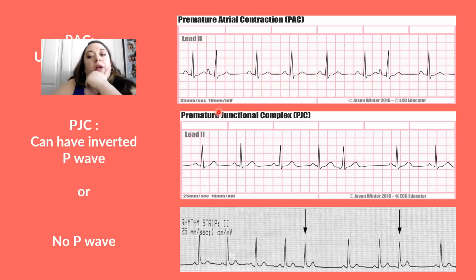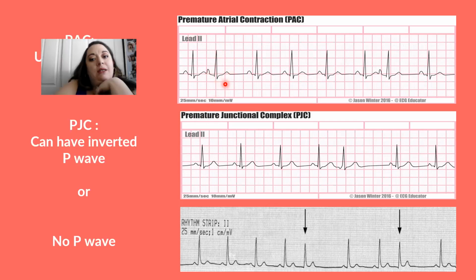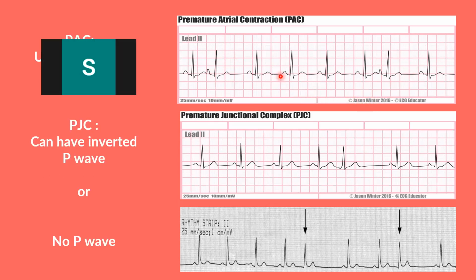But which beats do you think showed up early? The second. Yeah, number 2 and 7. Right? These can get a little tricky, guys.